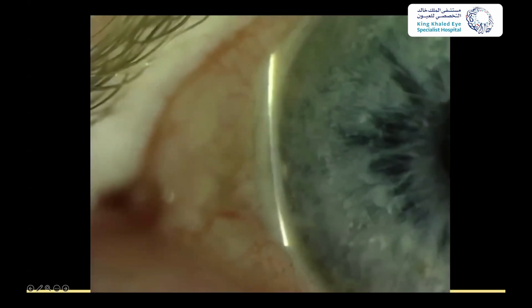And then this is a patient whose chamber is really shallow. You would expect on gonioscopy that this angle would be almost closed.